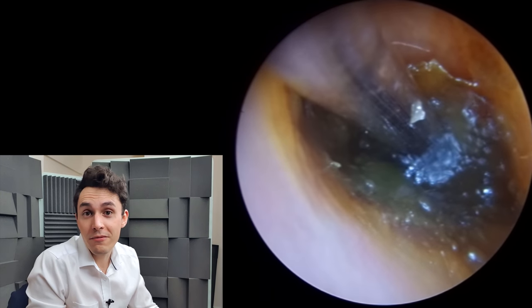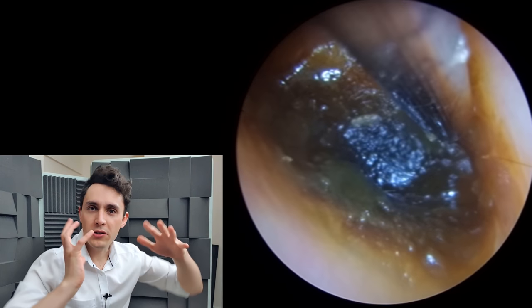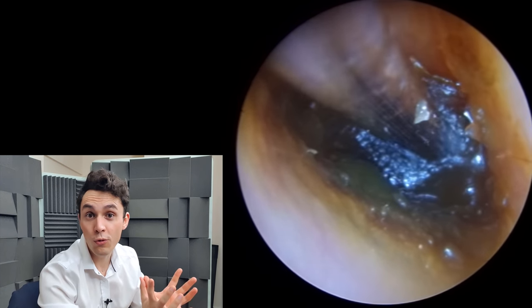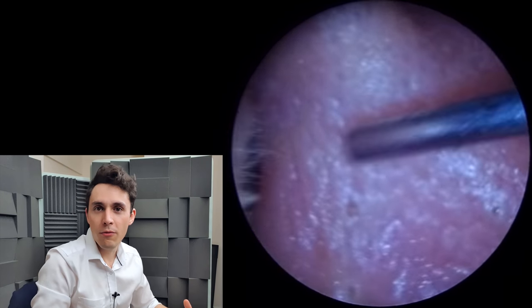It's made more difficult for two reasons. One, it's concave, and that means there's wax around the sides which is helping it adhere and cement to the canal walls — not the eardrum, the canal walls. And that is very difficult to peel away.